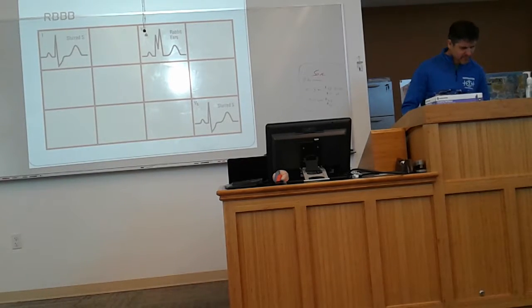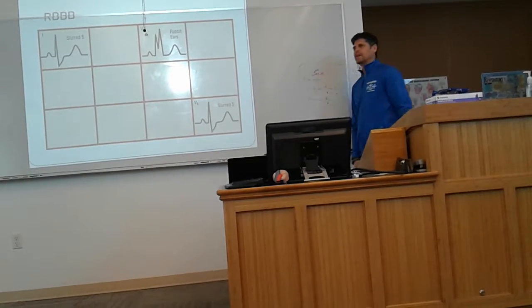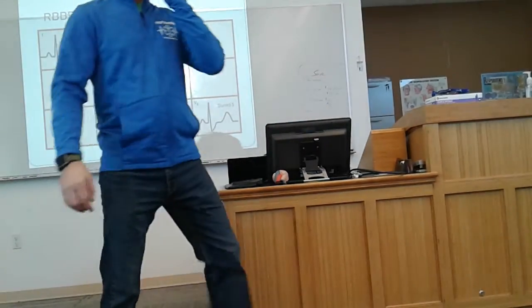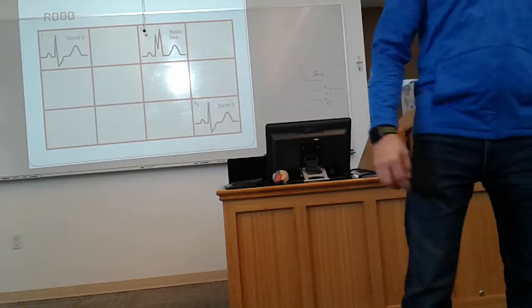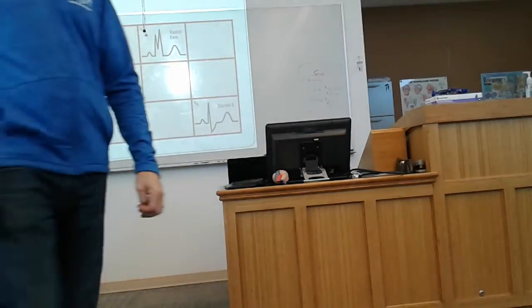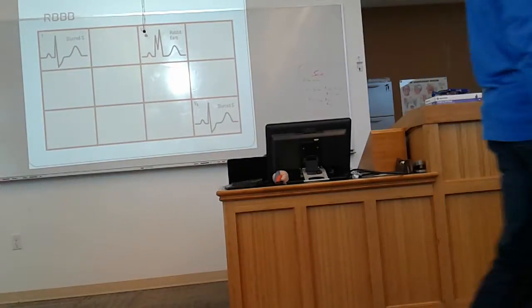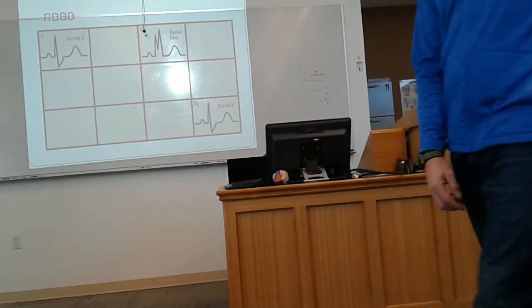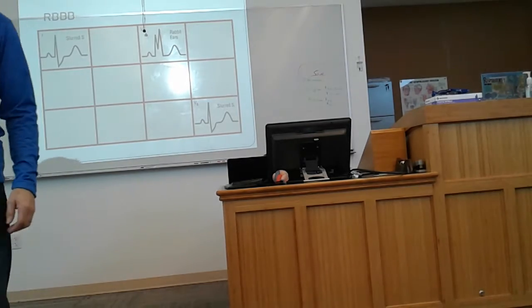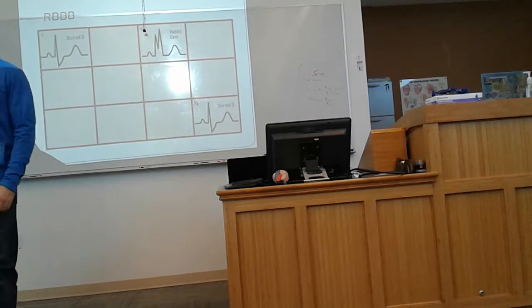Okay. Look at number 5. Do we have a supraventricular rhythm? Yeah. Do we have a wide QRS? Yes. What lead do you see that in? All of them. Look in what leads next? Lead 1. Do you see slurred S waves in 1 and V6? Yes. Where do you look next? V1. Do we have an RSR or R or QR pattern there?